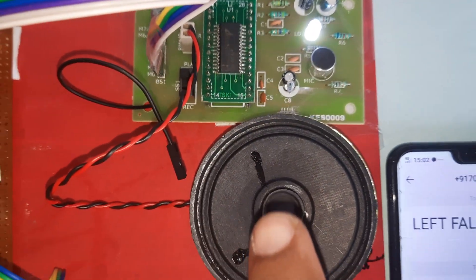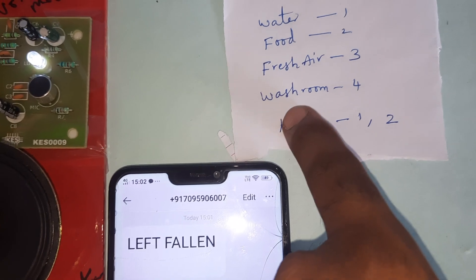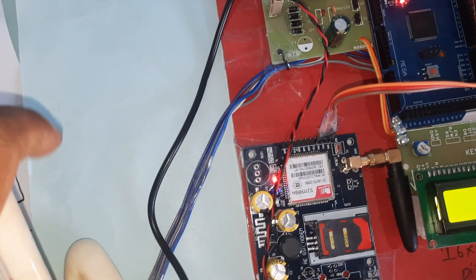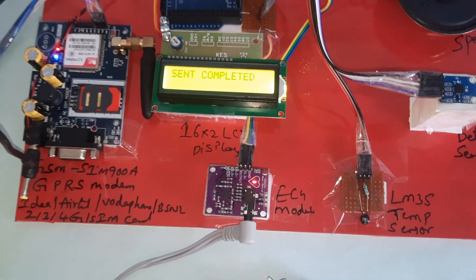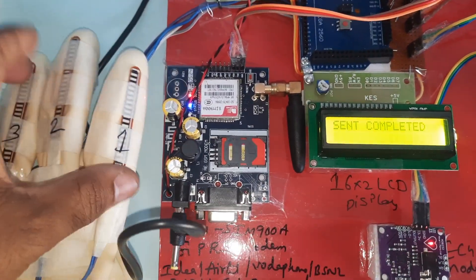Fourth finger bending — the system sends an SMS alert saying 'washroom.' GPRS is sending. Send completed.